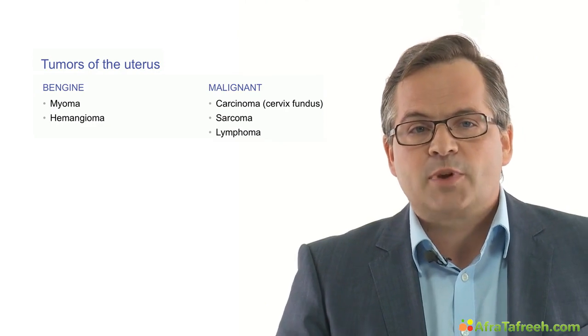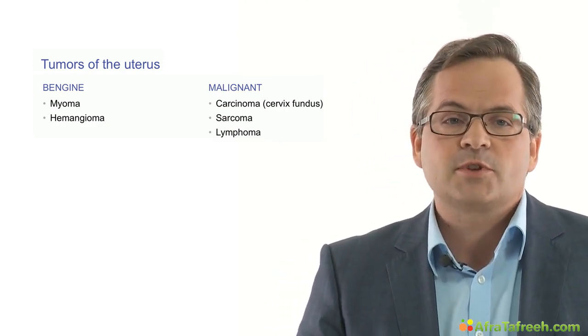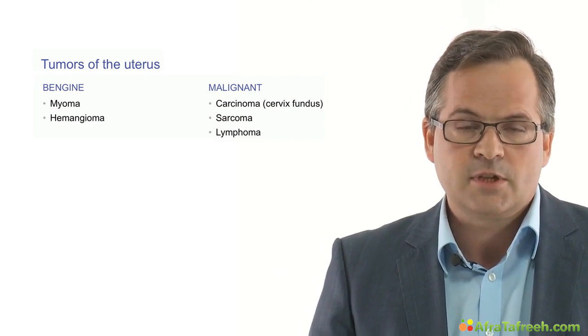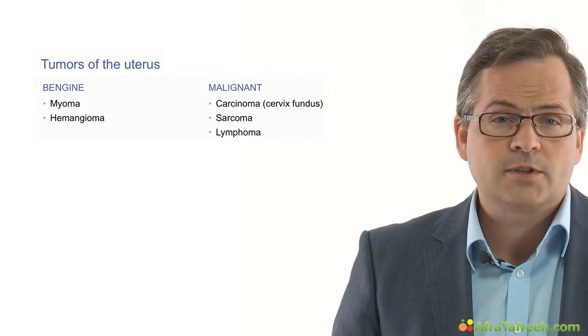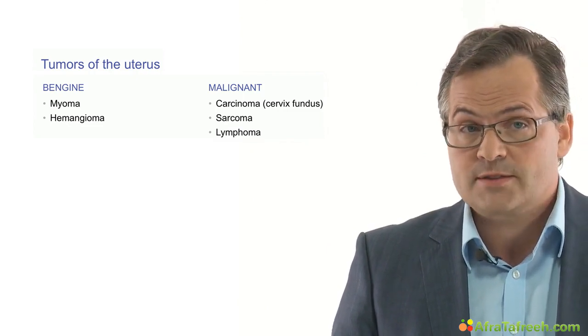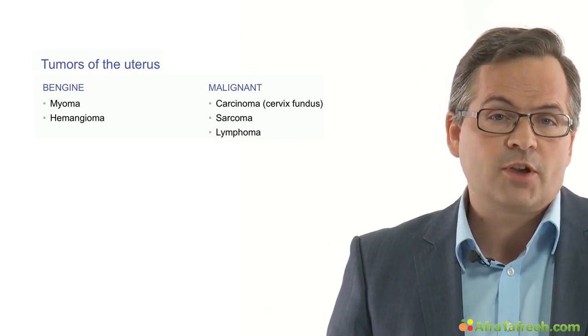Especially in the case of pains in the lower abdomen and the existence of a coil, an ultrasound examination is indicated. The origin of liquid in the uterus could be mucus, any liquid, blood or pus. And in any case, a tumor which may be blocking the drainage must be excluded.